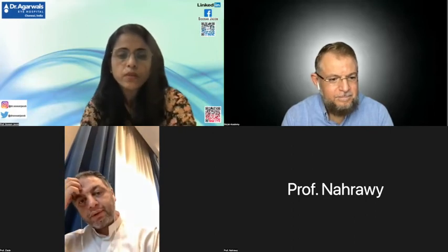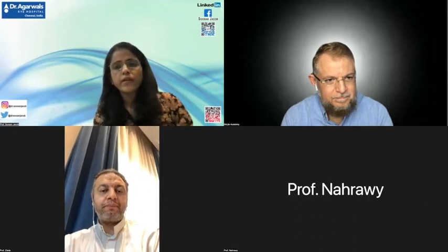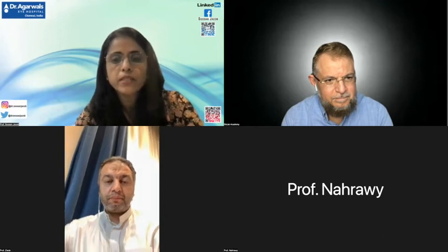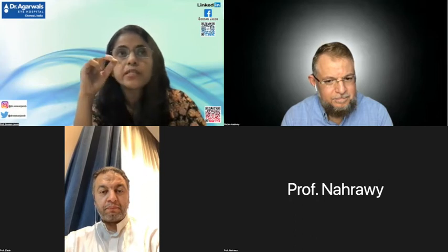So what about the results on using the nomograms? You have your own nomogram in calculation of the length, the arc length, or the thickness? Yes, we have kind of come to a stage where we are able to predict to some reasonable extent how much result we are going to get. We definitely know that when we put a segment here, we are going to get flattening here, and this is the area where we'll probably get some steepening. But we are still not able to predict exactly to a diopter.